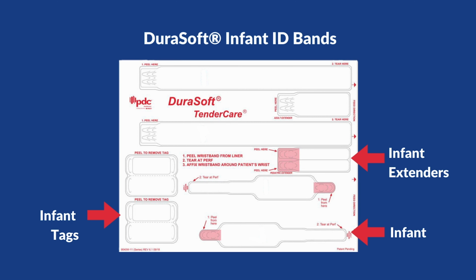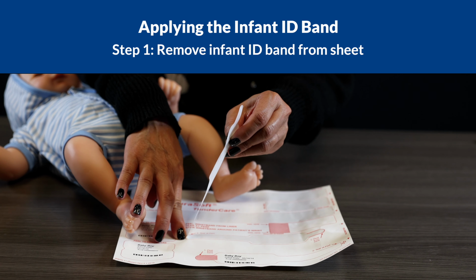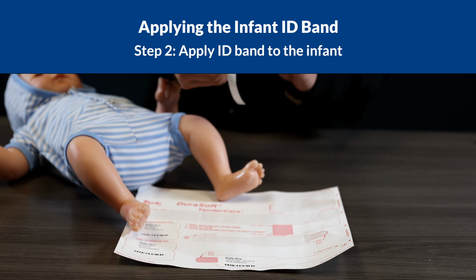For the infant's ID bands, follow the same process. Remove the infant's ID band from the sheet starting from where it says "Peel here." Pull to the other end of the band, then apply pressure and tear the band off the sheet at the perforation. The infant band can be applied to the wrist or ankle of the infant.